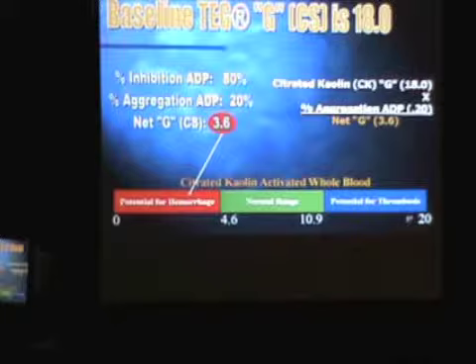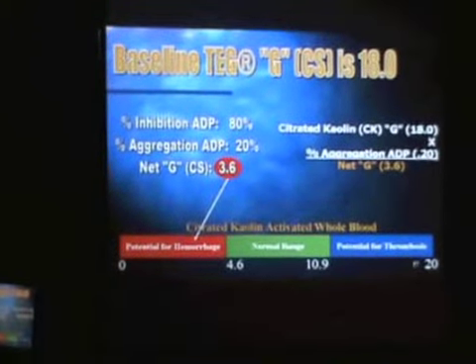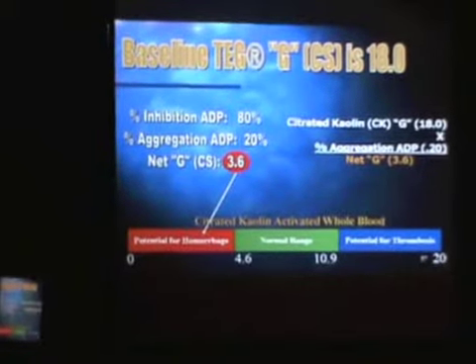The way to do it, and this is my discussion with the cardiologists, is that post-stent, if they've got a patient on 75 of Plavix pre-discharge, they should run a mapping. Because did they put that patient in this condition? If that patient gets into a car accident, they may not be able to clot.